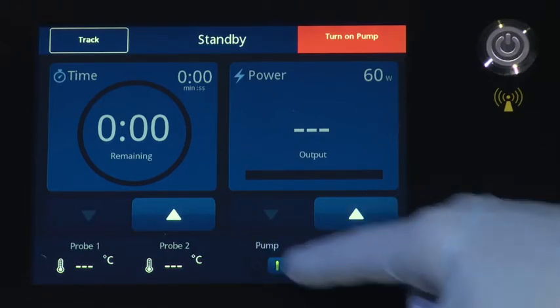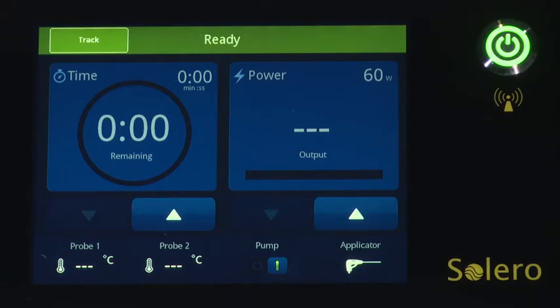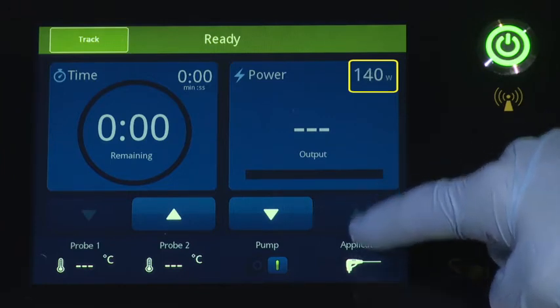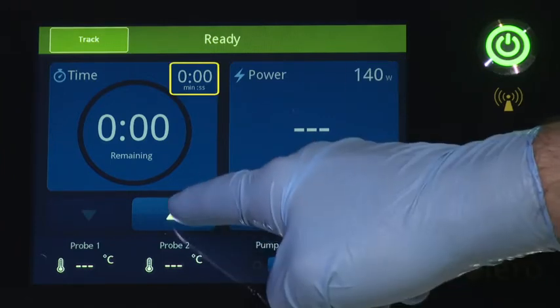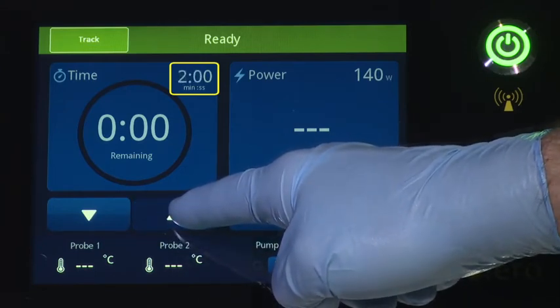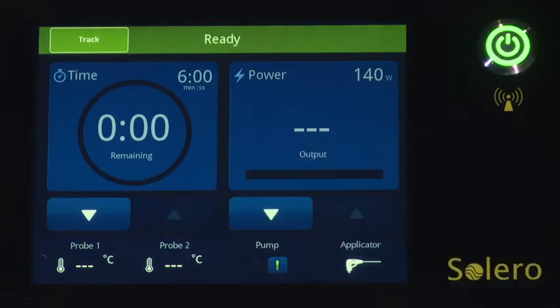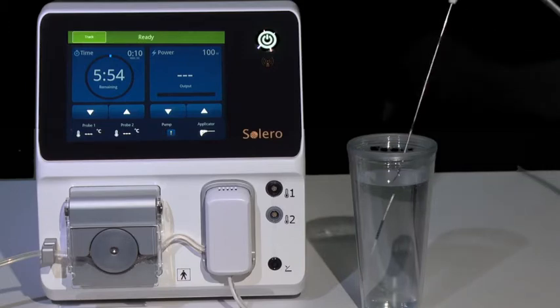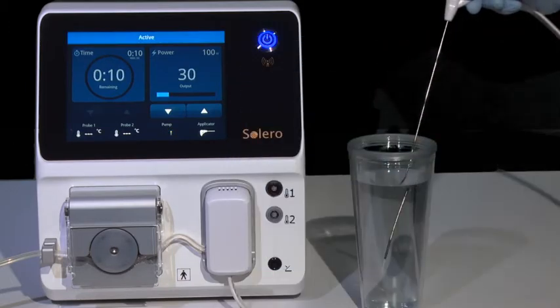The system will now be in ready mode and time and power can be adjusted. Using the up-down arrow buttons, adjust the time and power settings based on the desired ablation diameters. Before placing in the target tissue for ablation, place the tip of the applicator into a container of sterile water or saline and activate the device at 100 watts for 10 seconds to ensure that the system is functional.